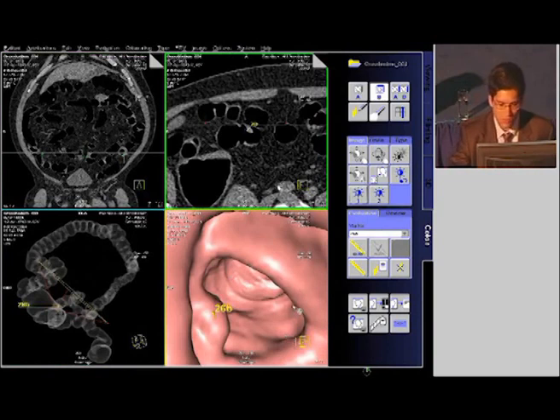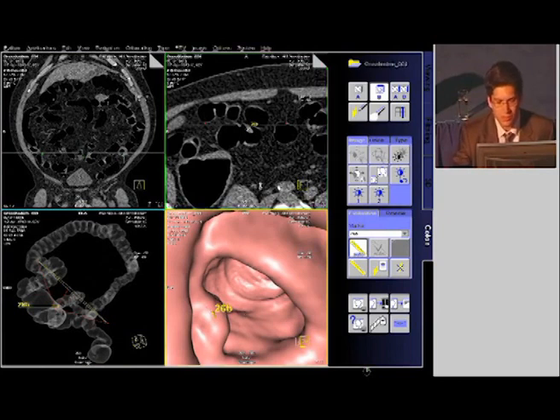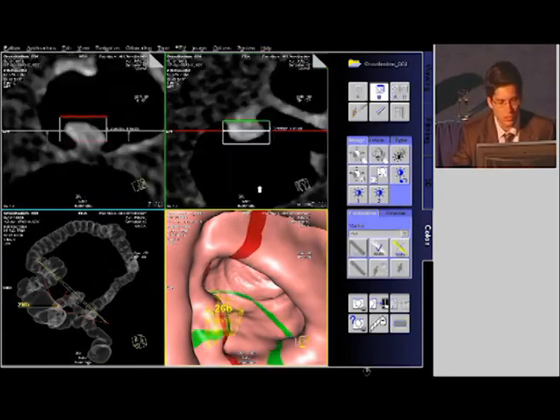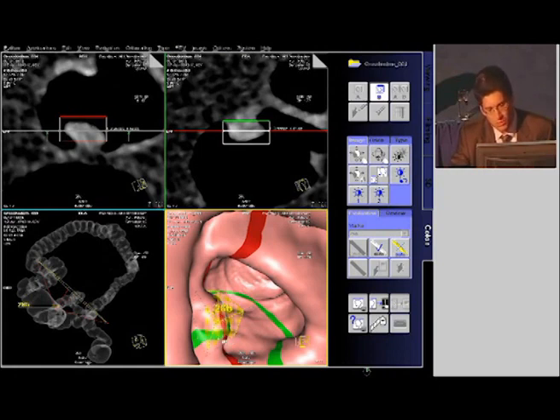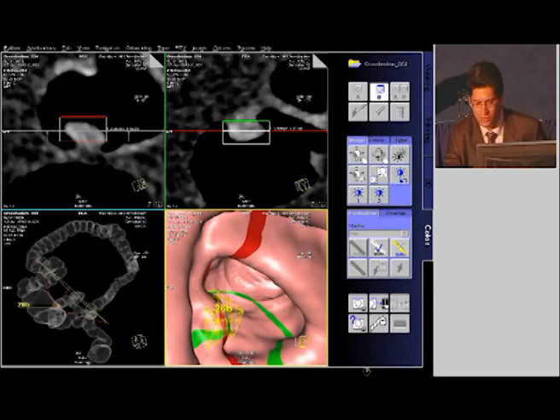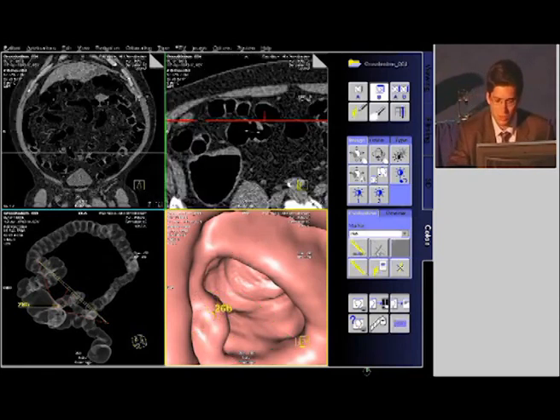The next thing would be to determine how big this lesion actually is. You can click on the auto-measurement tool right here, just click onto the lesion itself, and there's going to be a three-dimensional automatic morpho-volume measurement of that lesion. You can see those planes here — the red one being the coronal plane, this one being the axial plane — and these are the dimensions being displayed. If you like that measurement, just click onto this little sign here which accepts the auto-measurement.